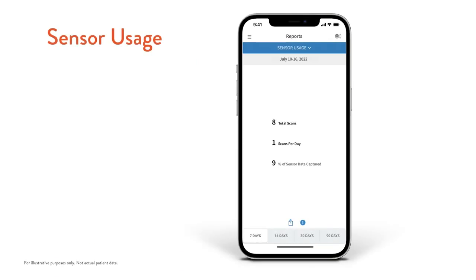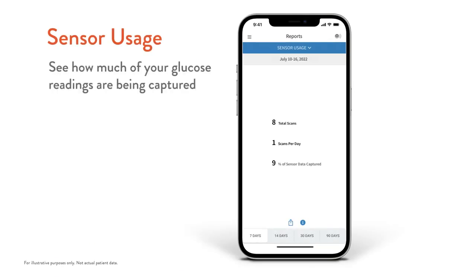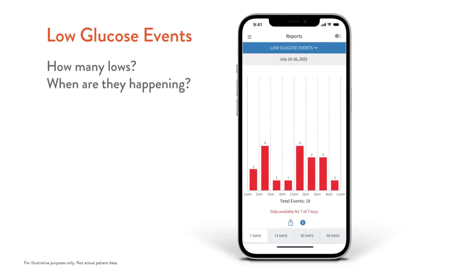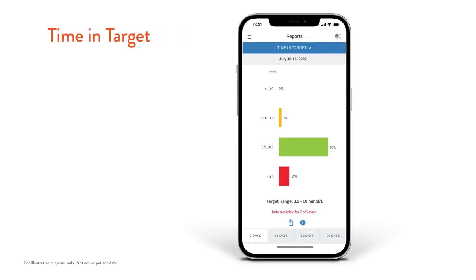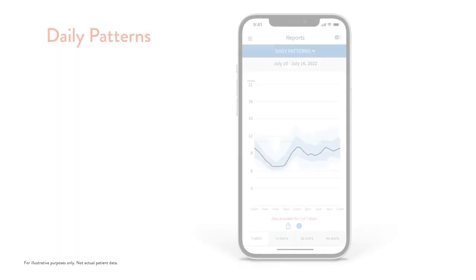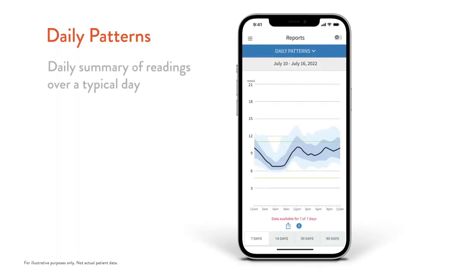The sensor usage report shows you how many of your glucose readings are being captured. The low glucose events report gives you information on how many lows you are having and when they are happening. The time in target report shows the percentage of time that you spend in, above, and below your target glucose range. Finally, the daily patterns report summarizes your readings over a typical day so you can see patterns.